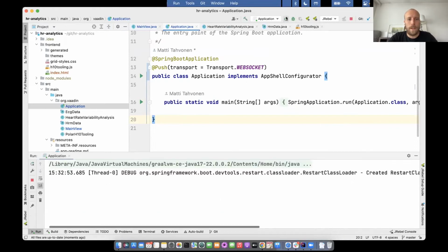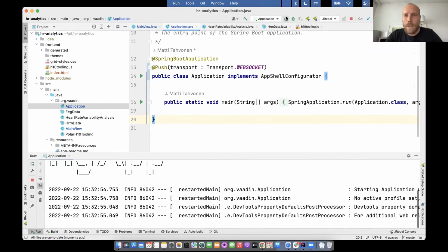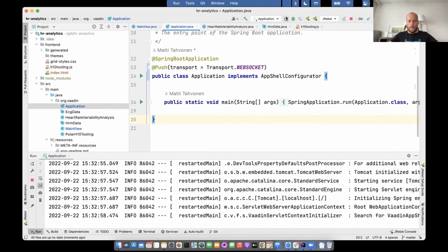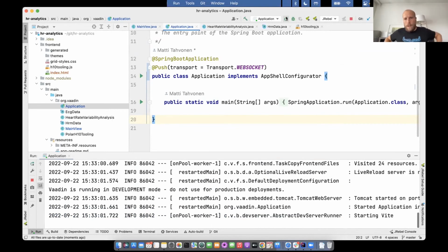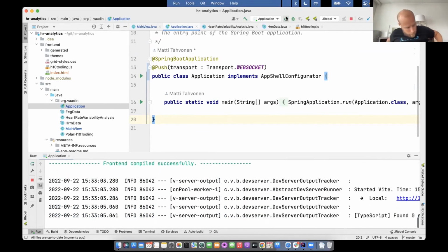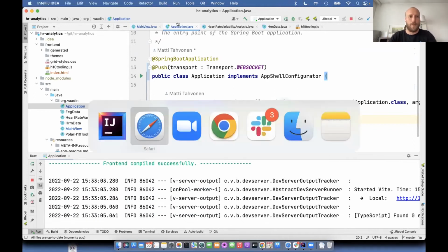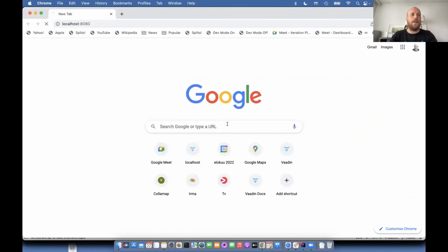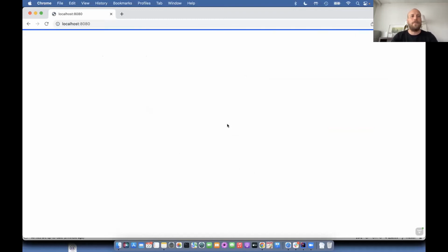So now I'm starting it up in the local environment, and at the same time, I think I will install this heart rate belt for myself. So now I'm wearing the belt, and now I need to switch from Safari to Chrome because Safari didn't support that, and I should have the application running at localhost 8080.